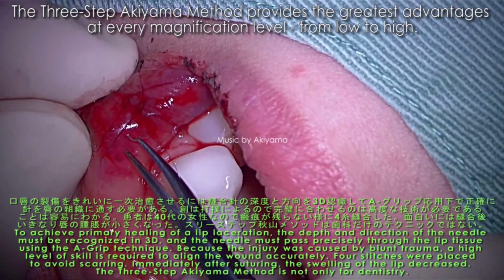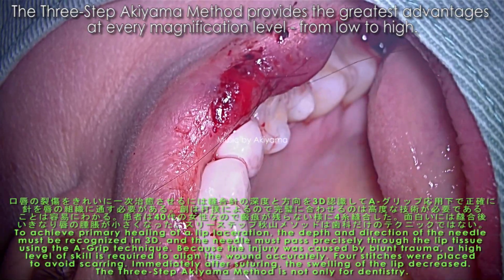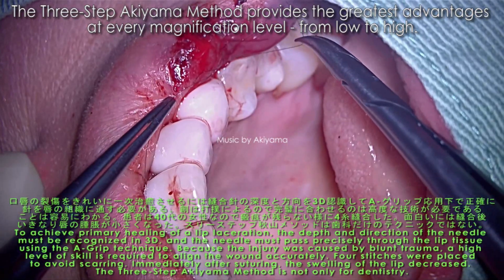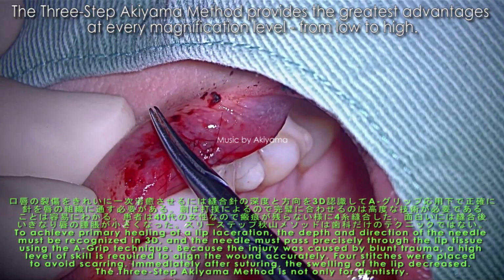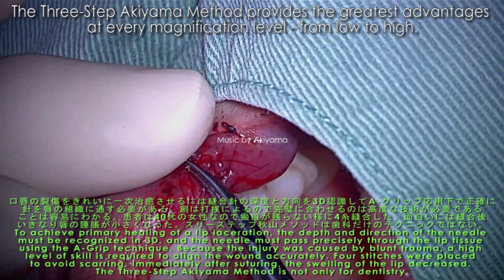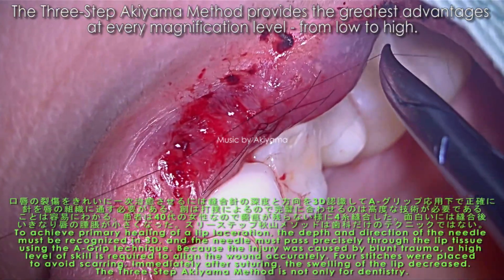To achieve primary healing of a lip laceration, the depth and direction of the needle must be recognized in 3D, and the needle must pass precisely through the lip tissue using the A-grip technique. Because the injury was caused by blunt trauma, a high level of skill is required to align the wound accurately. Four stitches were placed to avoid scarring. Immediately after suturing, the swelling of the lip decreased. The three-step Akiyama method is not only for dentistry.